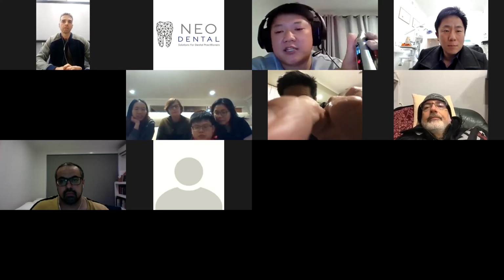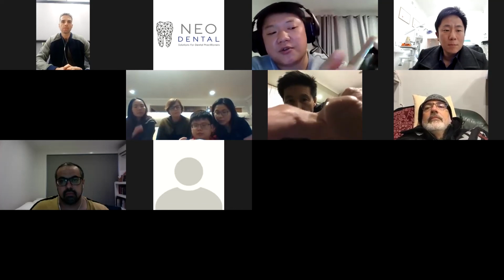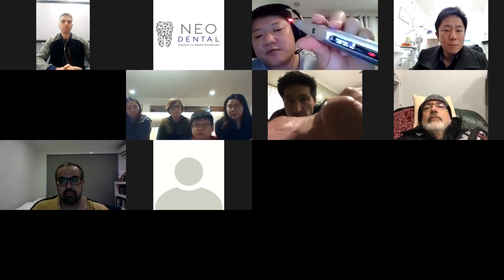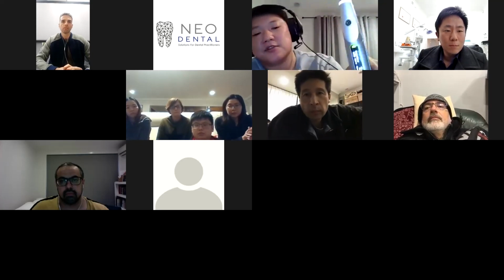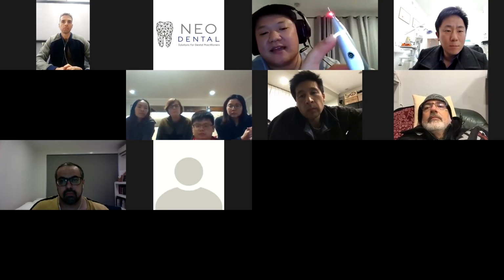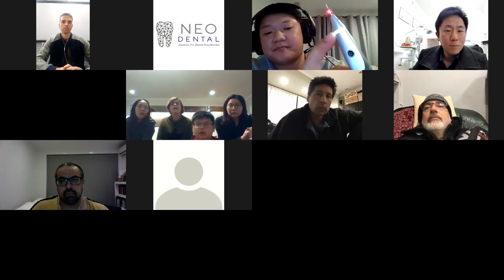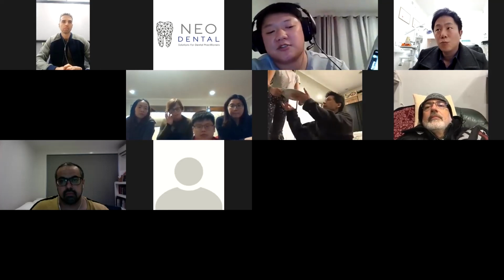I find continuous just works well for me, and I haven't felt the need to change. So I click on standard. That's ready to go. But what you'll notice is you actually have to push down the circular button, and then the front part here lights up. That means that the laser is ready to go. Right. Oh, okay. Yeah.